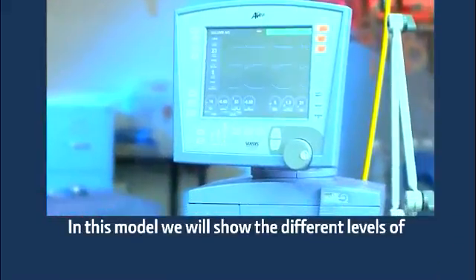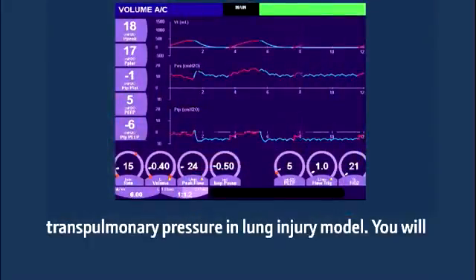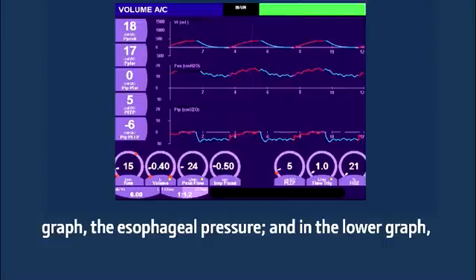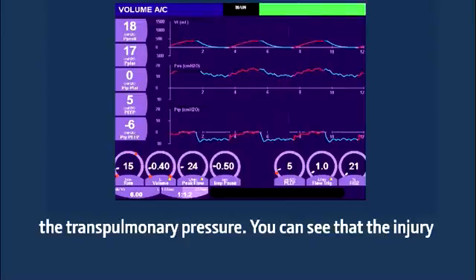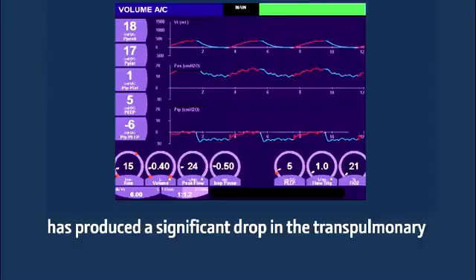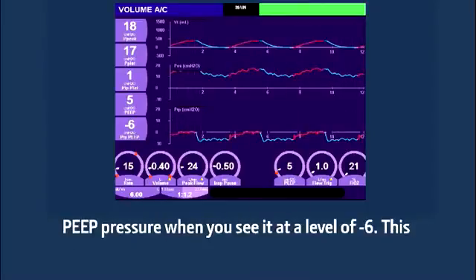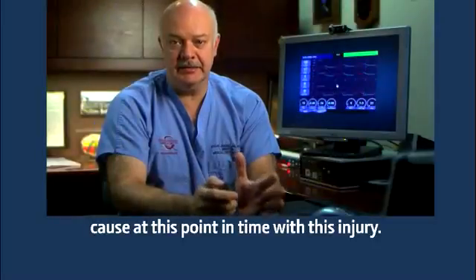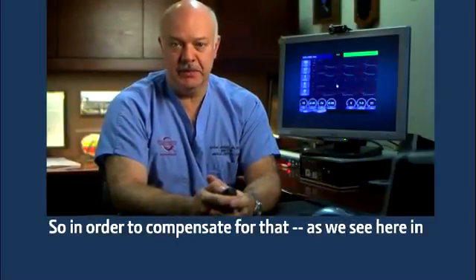In this model, we will show the different levels of transpulmonary pressure in a lung injury model. You will see in the upper graph the tidal volume, in the middle graph the esophageal pressure, and in the lower graph the transpulmonary pressure. You can see that the injury has produced a significant drop in the transpulmonary PEEP pressure, to a level of -6. This means that there may be some significant atelectasis caused at this point in time with this injury.